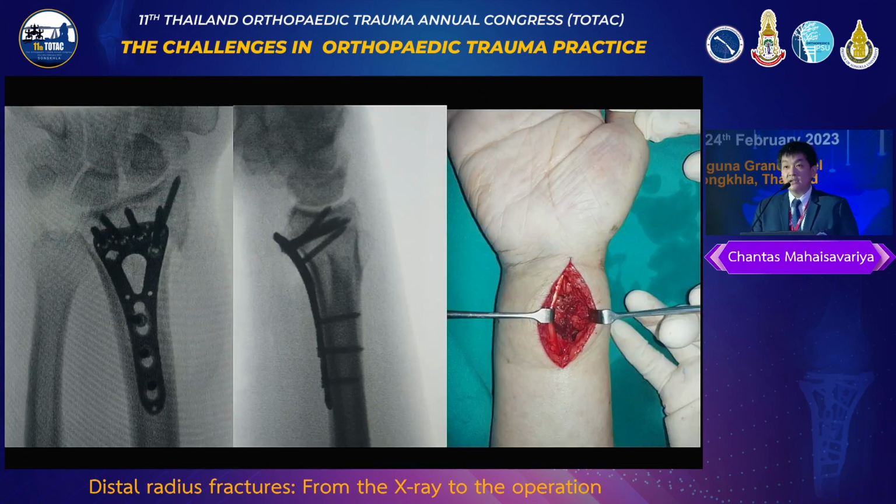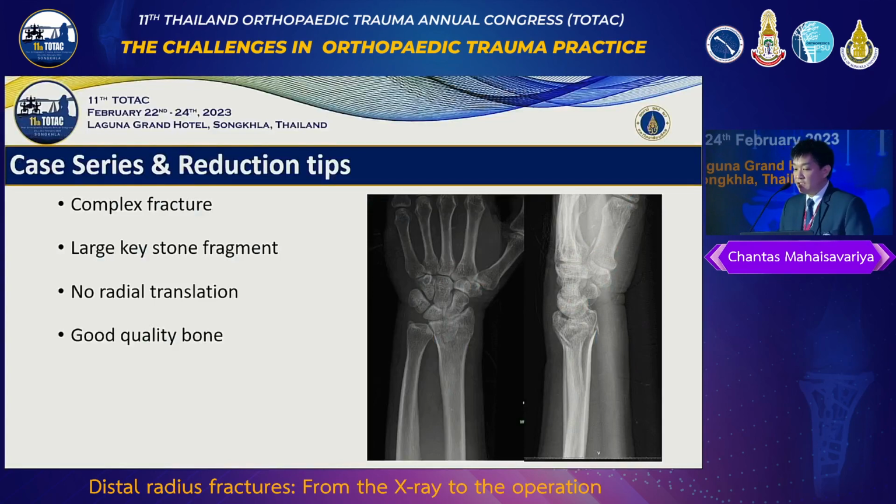And then I close it like this to decrease, let's say, to decrease the flexor tendon tear and to cover the plate so that I can assure that the patient can go home. Another case is, this one is a little bit complex.